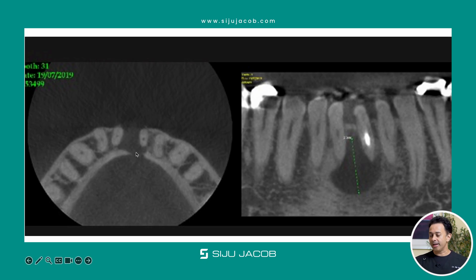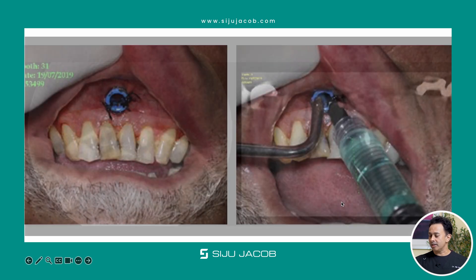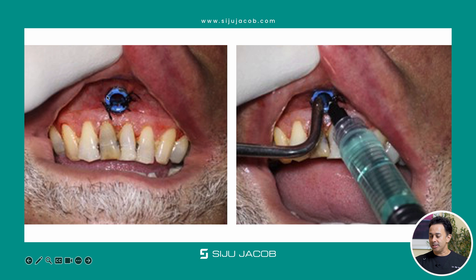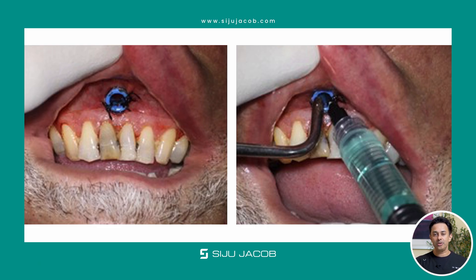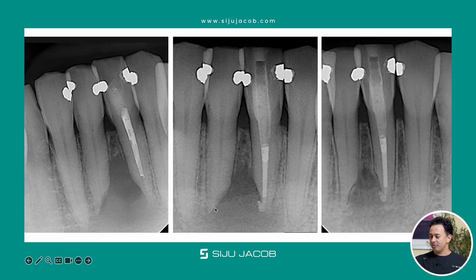Here's another case also from Venkid — a mandibular incisor with a through-and-through lesion, a very large lesion. Using the same methodology, you can see the drain inserted here, and then irrigation is performed through this drain. The irrigation can be done by both the patient as well as the clinician. And here is the post-op of the same case, with the lesion completely healed without the need for surgery.